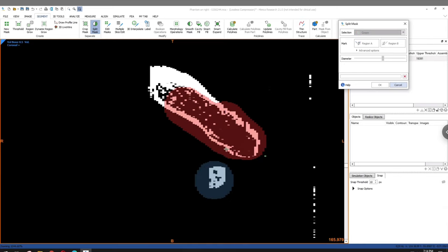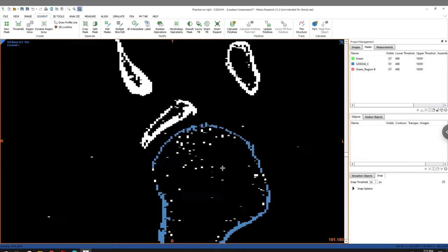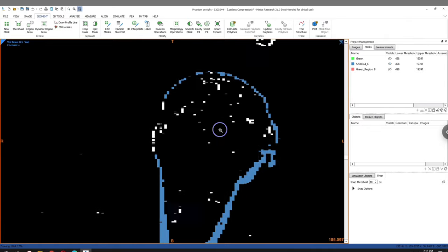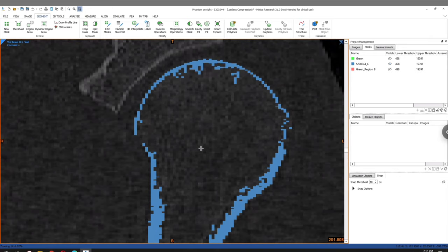Now for this particular step, I usually like to isolate the most proximal aspect of the humerus, as it allows us to get rid of a lot of the speckling pattern that is the result of more dense trabeculae in the humeral epiphyseal head. As you can see here, my original split mask seems to have worked out pretty well, and although this isn't a perfect humeral image, it at least gives me a baseline on which to begin my process.